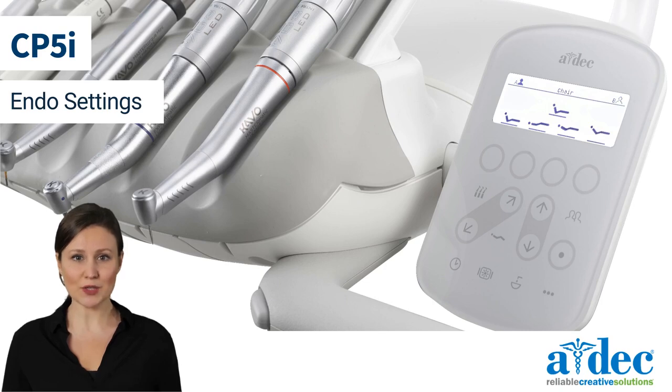In this video, we will discuss adjusting Endo settings on a CP5i control pad.